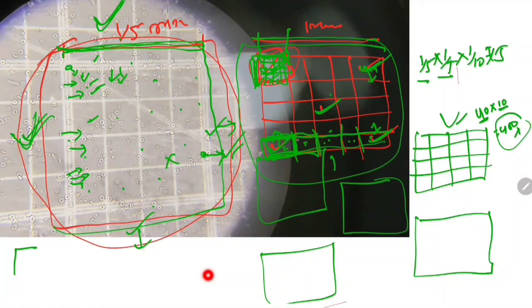Because this is the left of this box. This right of this box is actually left of the next box. So we should exclude, or we can say this cell should go in the next box. And same thing lower, this cell should go in the lower box.